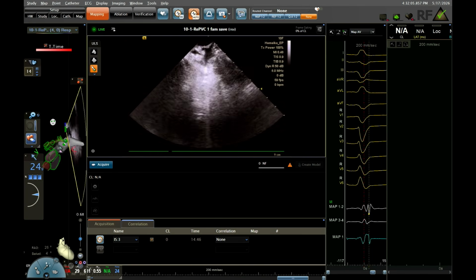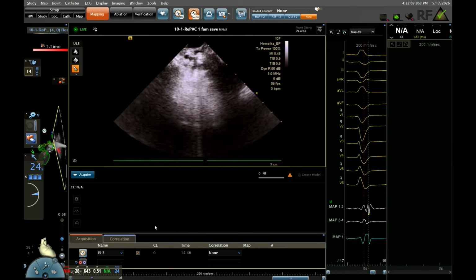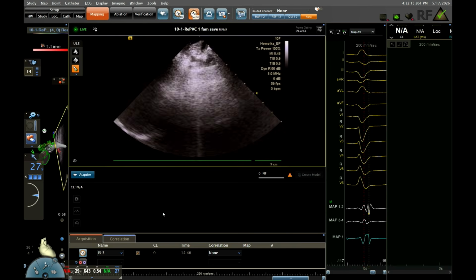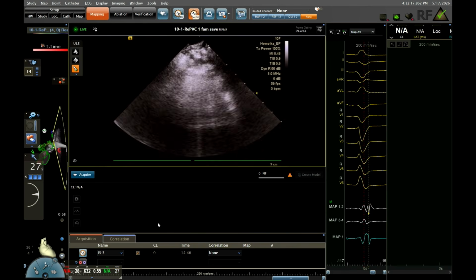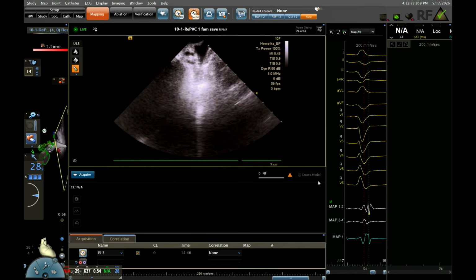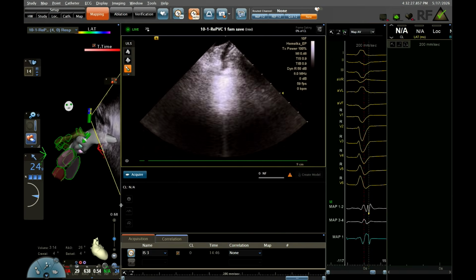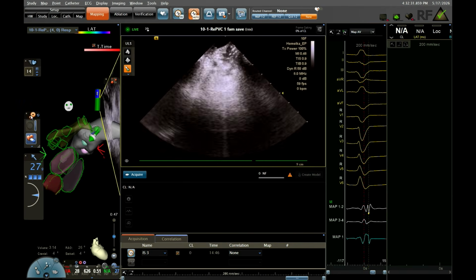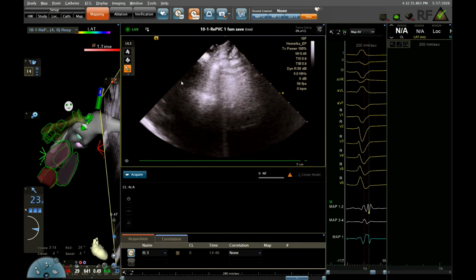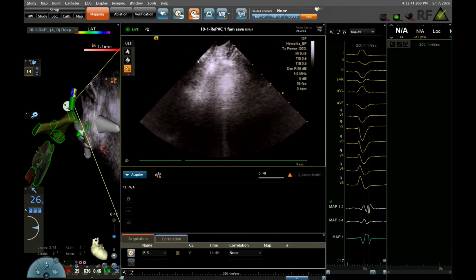Now, I want you guys to remember that in today's anatomical lecture, which again was excellent, when the LV summit was presented, he said that the best way to see the LV summit is from the pulmonary artery. Well, I was listening, and I have listened before, and this is intracardiac echo from the left pulmonary artery. Don't make it that big so they can see the reconstruction, okay? When you advance the intracardiac echo into the left pulmonary artery, you see that structure right there, the circle. The main circle in the center, that's the LAD, okay? The pulmonary artery is on top, the left ventricle is on the bottom.